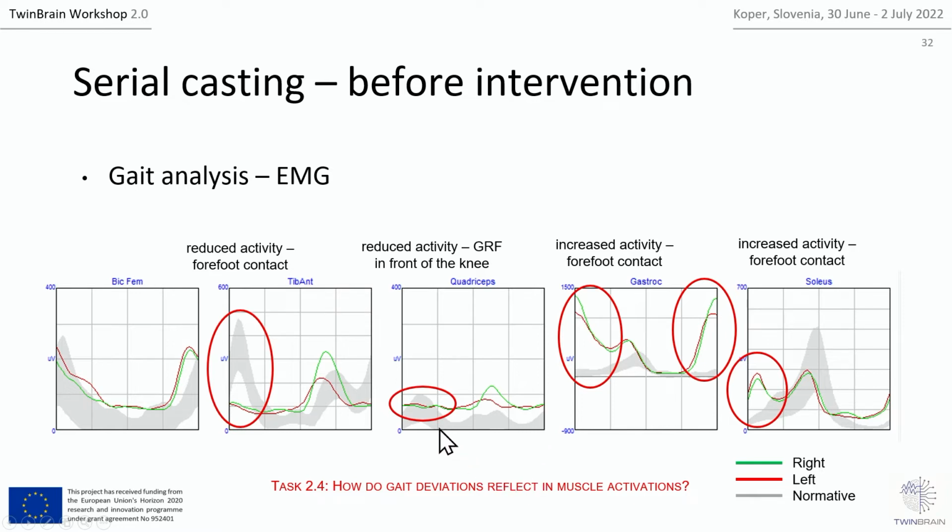What we also notice is that there is a quite significant increase in the activation of the plantar flexor muscle groups. Immediately at the start of the gait cycle, when the weight is being shifted towards the leg in stance, both of these muscle groups are quite active. We also notice a lack of activity in the tibialis anterior muscles during the weight transfer because of the toe contact.